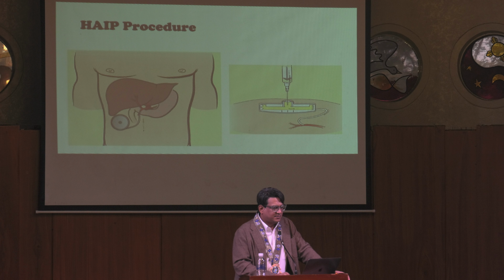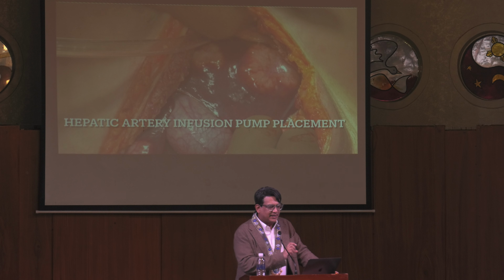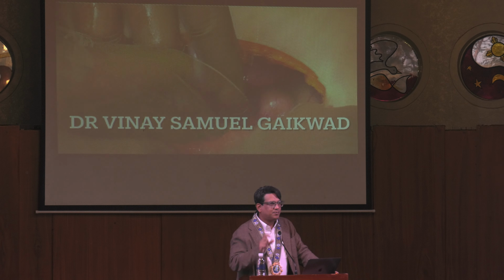So we place this catheter inside. Another video I'm showing you. These are the metastasis. That means the cancer spread in the liver. Can you see those white spots?